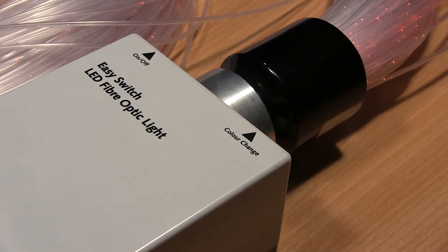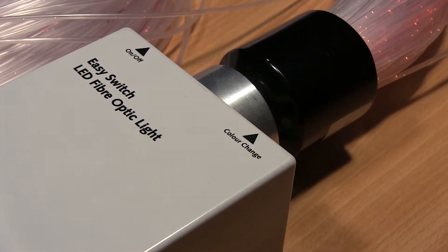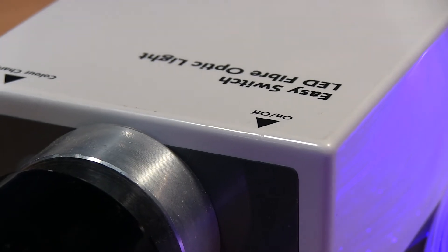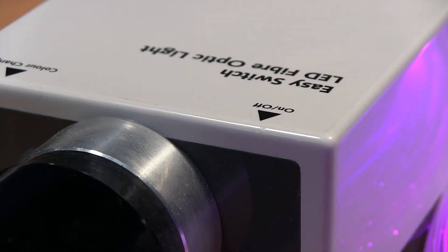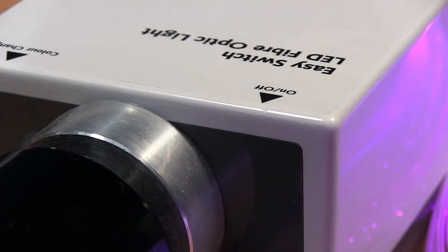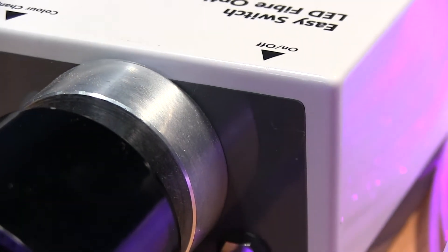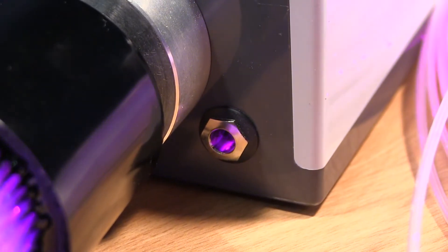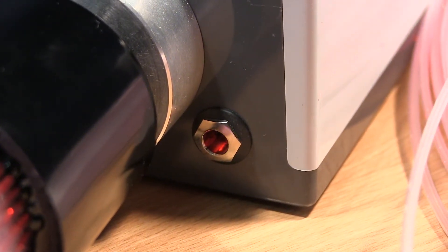Let's plug a single switch into those and see exactly what they do. At the top there, you can see it says Easy Switch LED Fibre Optic Light, and just in front of it, it says on/off. That indicates that when you plug a switch into that socket, it's going to switch it on and off.